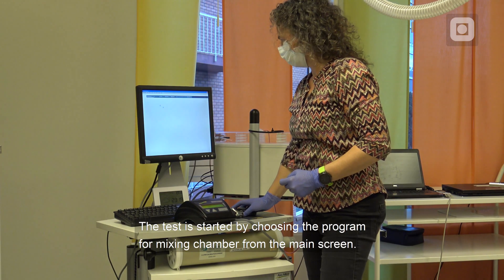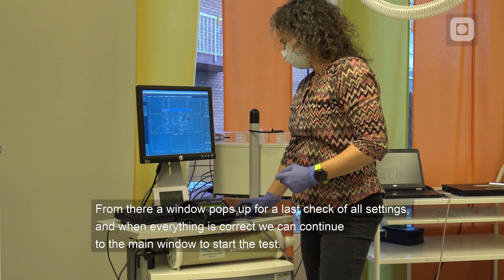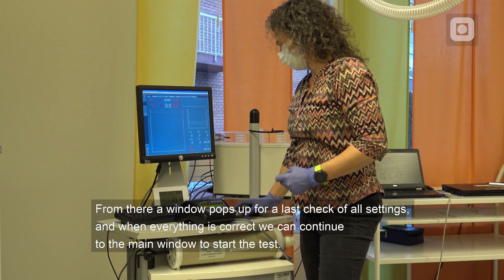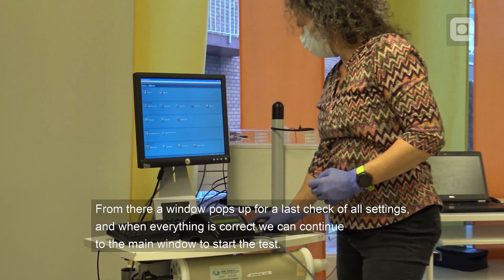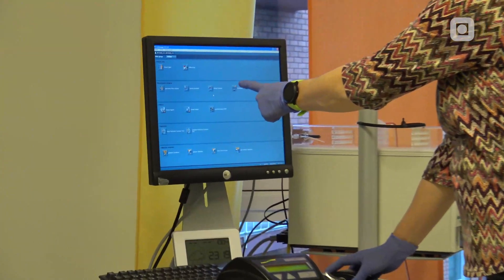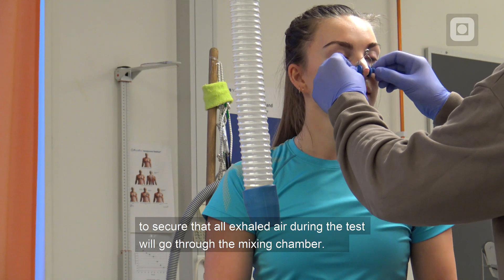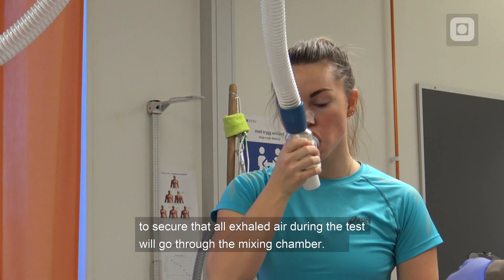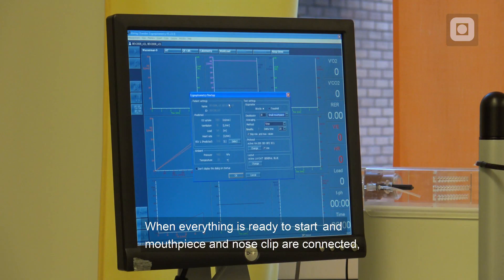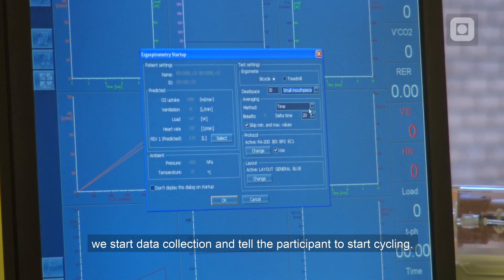The test is started by choosing the program for mixing chamber from the main screen. A window pops up for a last check of all settings, and when everything is correct, we continue to the main window to start the test. The participant tries out the mouthpiece and gets a nose clip as well to secure that all exhaled air during the test will go through the mixing chamber. When everything is ready and the mouthpiece and nose clip are connected, we start data collection and tell the participant to start cycling.